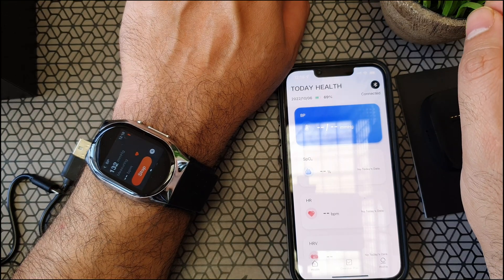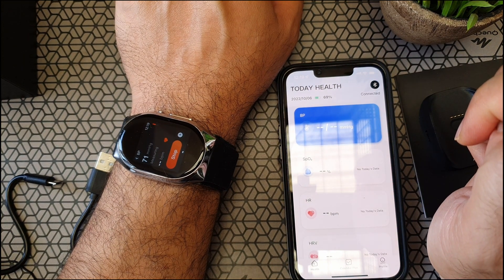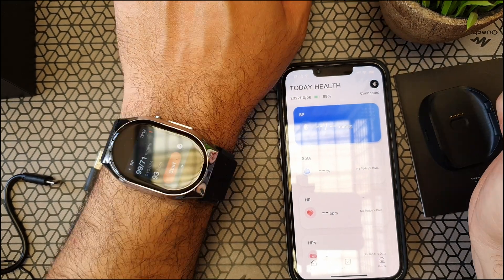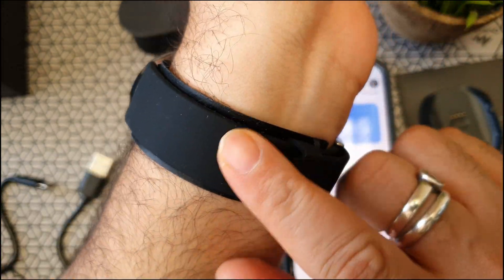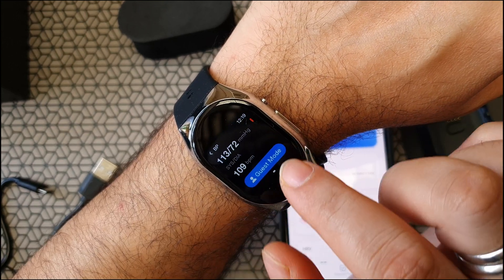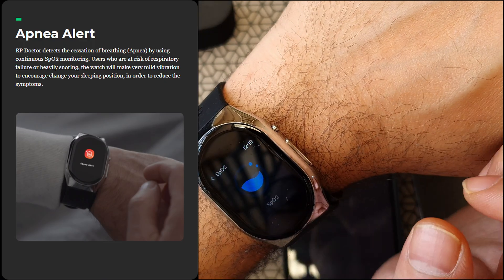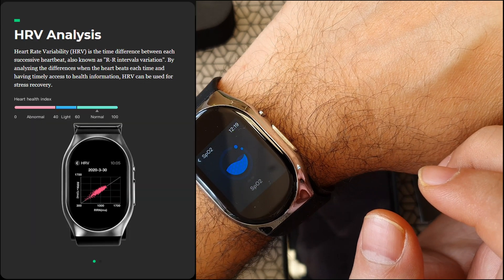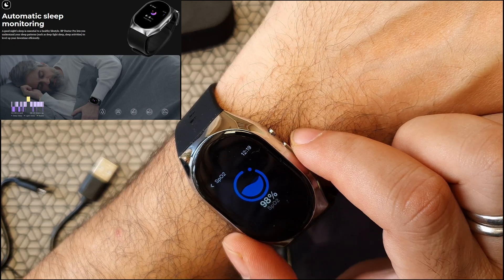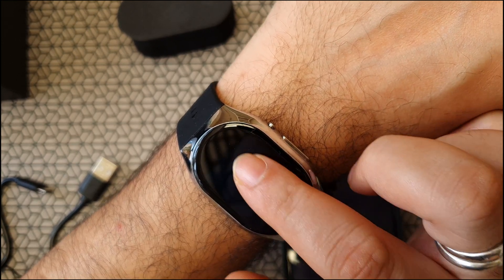I did one more check and got the error code again — probably because of my hand position. I can agree it was a little frustrating to get it to work consistently, and sometimes the readings look way off. One reading said 99 by 71, which I don't think is accurate due to movement. The watch has other features: sleep apnea alert, heart rate variability (HRV) readings to track heartbeat movements, sleep monitoring, regular heart rate and SpO2 readings — which almost all watches have nowadays — and a workout mode.